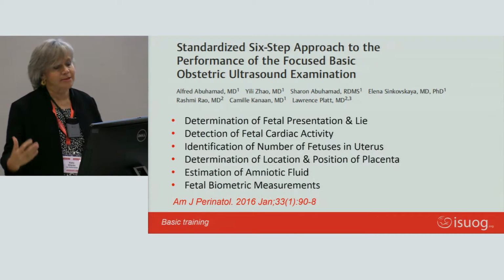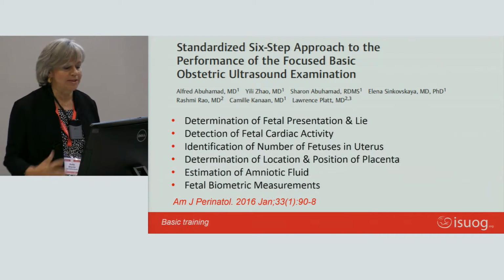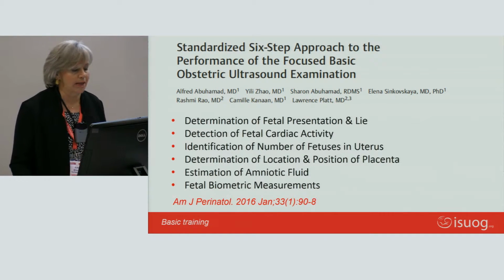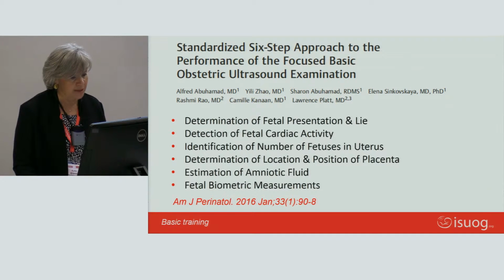The next step will be to perform fetal biometry correctly, but I will not cover this last point because it will be the subject of a next lecture.